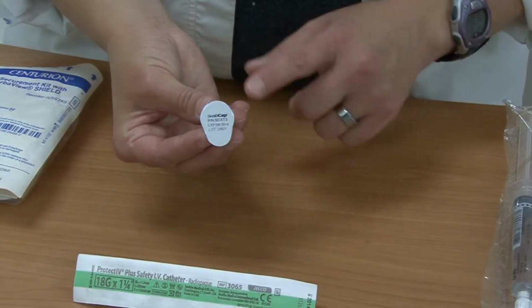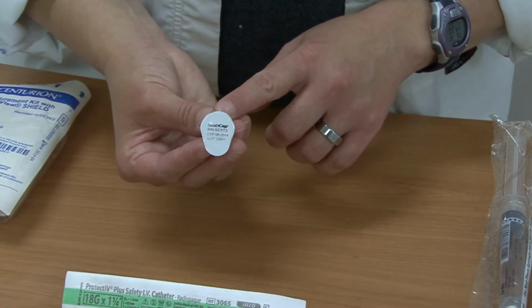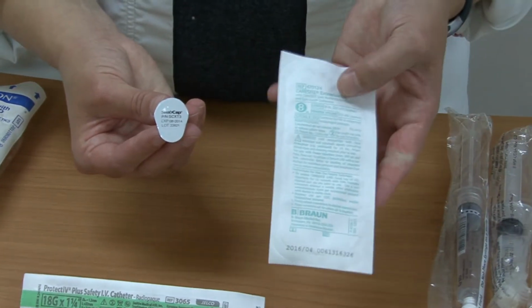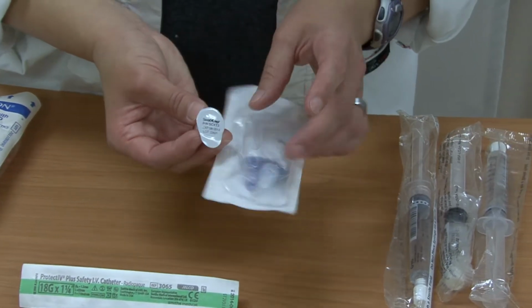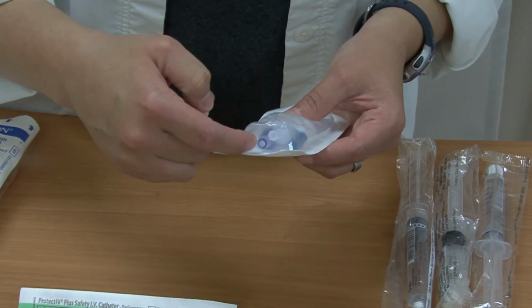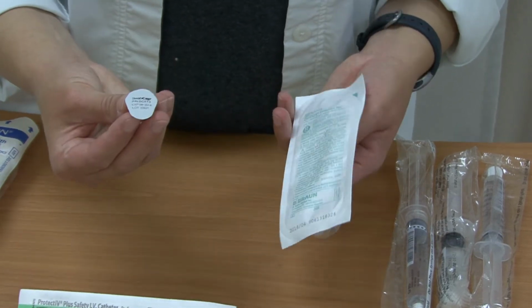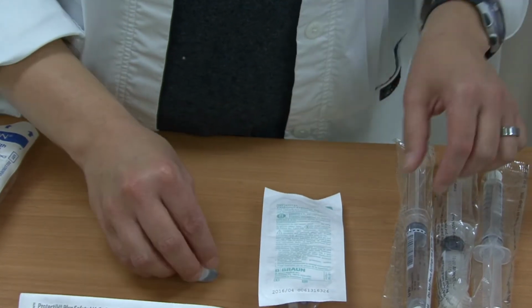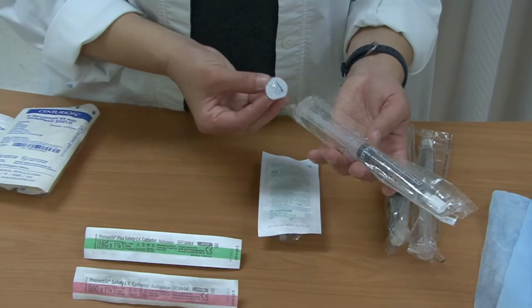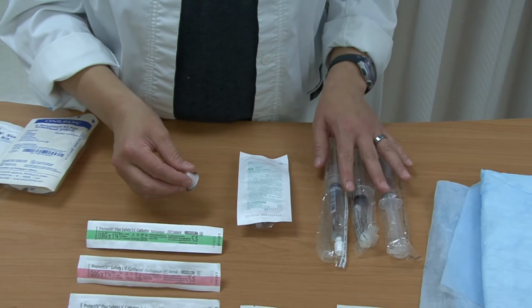Another thing you might see would be the swab cap. This is a cap that is impregnated with alcohol, and it goes on the end of the extension set so that it keeps it swabbed and bathed in alcohol, which helps prevent infections from your IVs. Some of your agencies have the swab cap that comes on the end of the saline flush, so make sure you're looking for that if it's there.